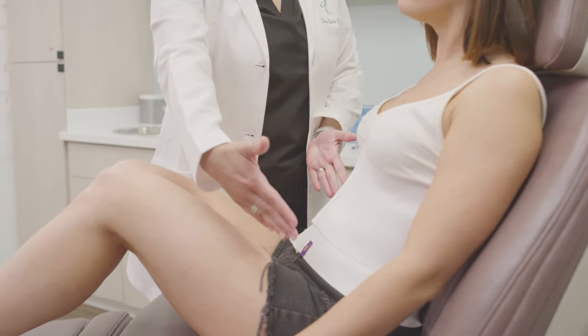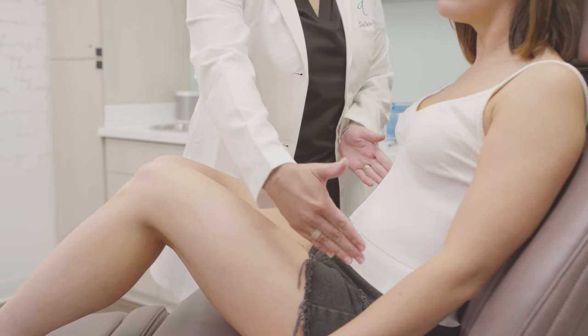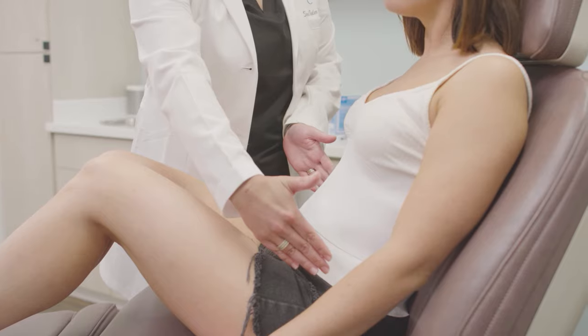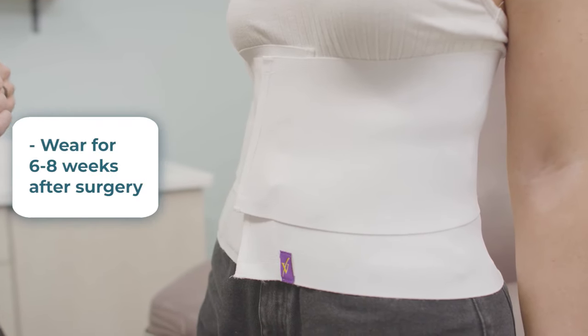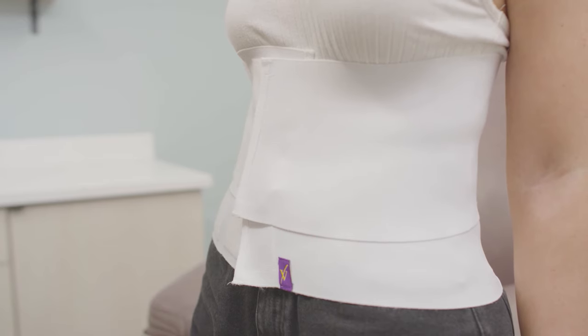Consistent compression is necessary for your body to heal properly, so you should wear your abdominal binder around the clock, only removing it to be washed. You should expect to use your abdominal binder for approximately six to eight weeks after surgery. You may purchase an additional binder to alternate between if you would like.